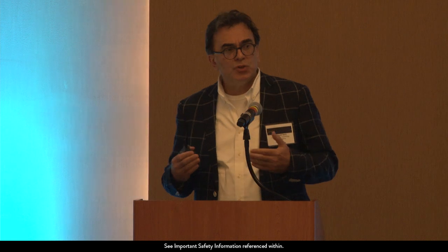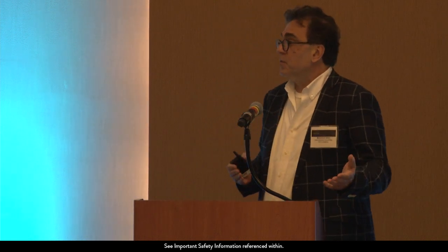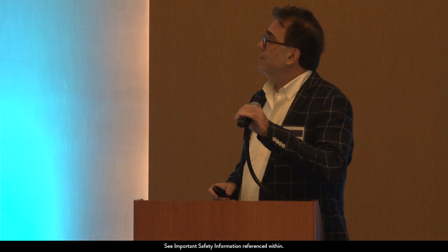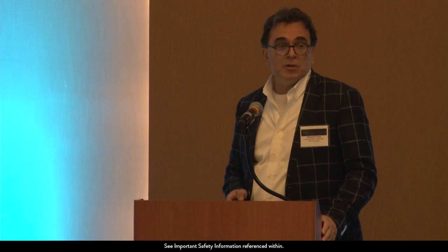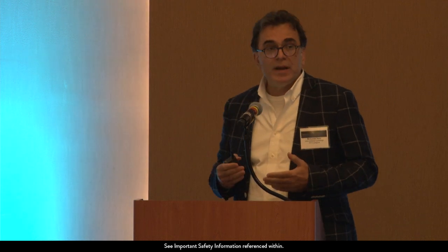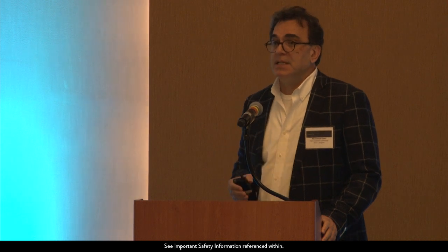And then I mentioned to you that we can repurpose CTs that were done for different reasons, like pre-AF pulmonary vein isolation and ablation. And this is the image from a CT using 3mensio. I really have to give credit to my dear colleague, Dr. Alan Wainrip, who is an exceptional imager, who taught me how to do this. And from this, you can generate pseudo-TE images from CT images.